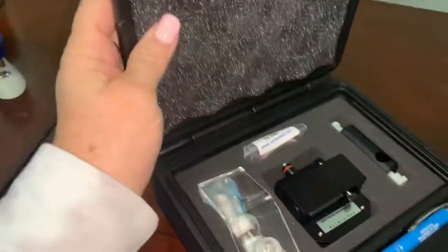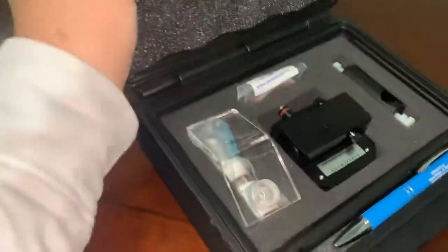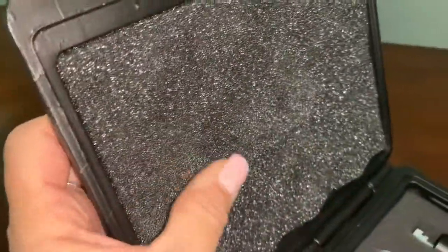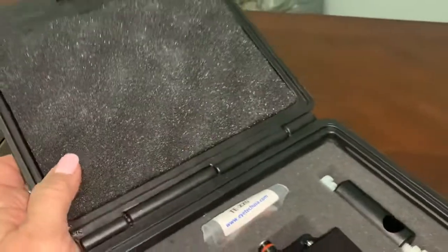First of all, they come in a nice hard shell case, which is great for me and my trainers because we're always flying here and there. It's got really nice padding, so you know that your model eye is going to be in good shape when you get where you're going.